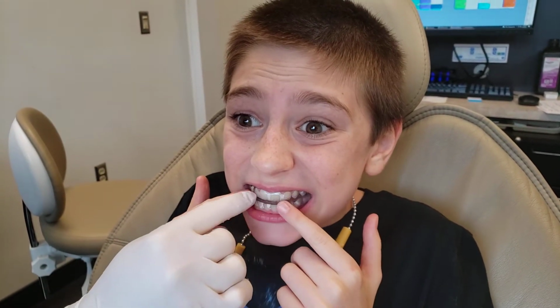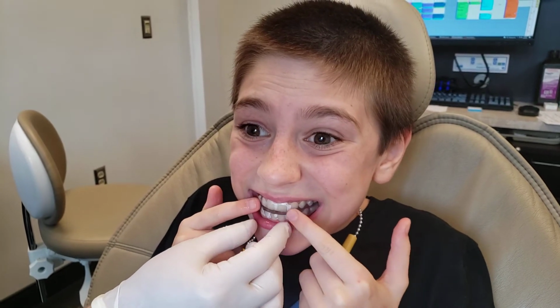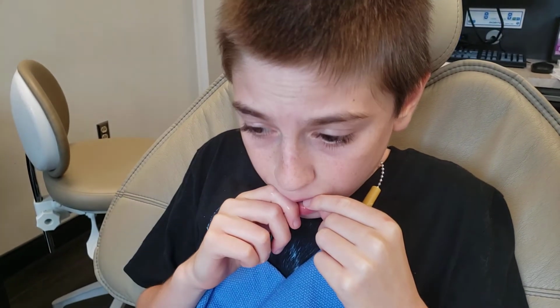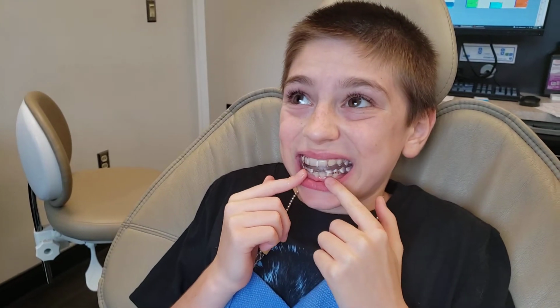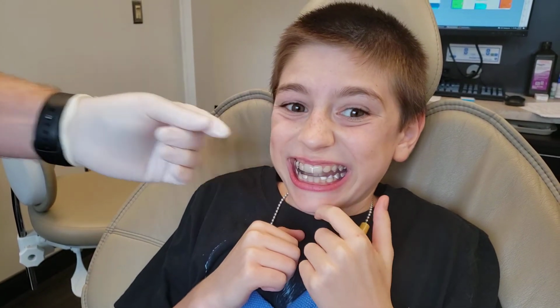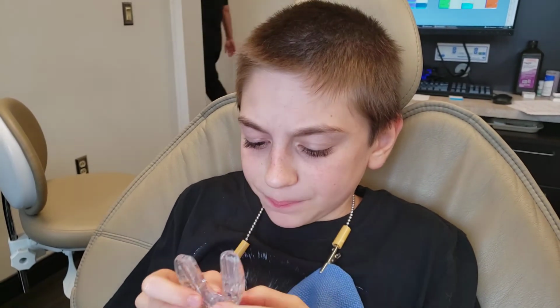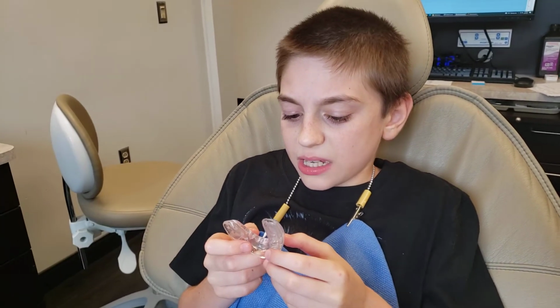Great job. So each tooth has a slot for it, and if it doesn't fit in the slot, then the guide kind of moves it to the slot. And it helps expand his arch as he wears it. And as the permanent teeth come in, if he didn't have the guide, sometimes they would come in too far towards the cheek, especially the canines. So this helps catch him, and whenever it's in there, the pressure between the guide and the opposing teeth helps to kind of grow the arch.